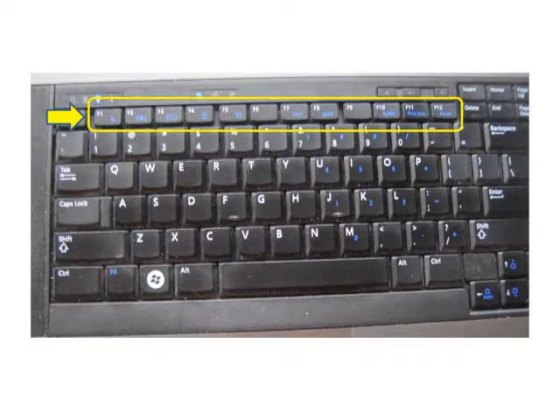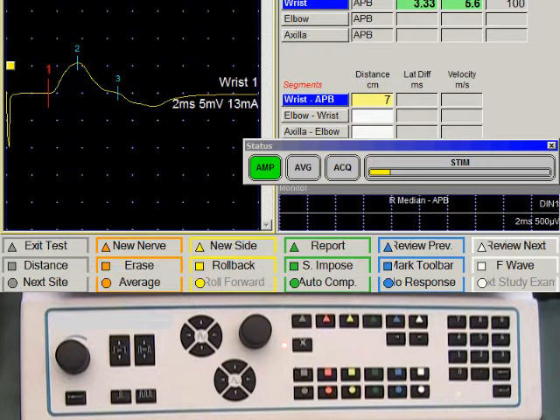The Synergy PIU system had 12 function keys that were accessed from the computer keyboard. We have the same 12 function keys now arranged in 2 rows. They are color coded and they have different symbols. The associated functionality is indicated at the bottom of the display.